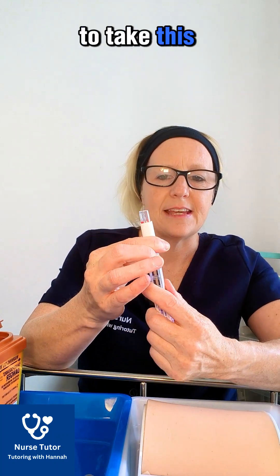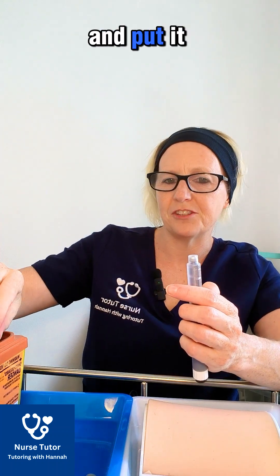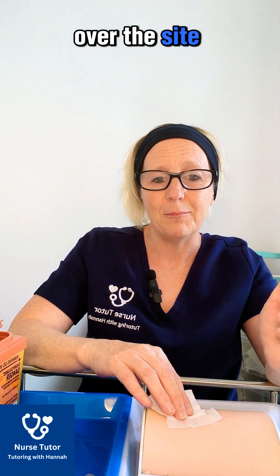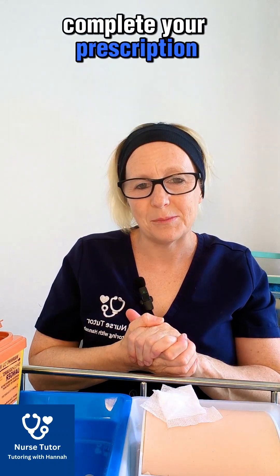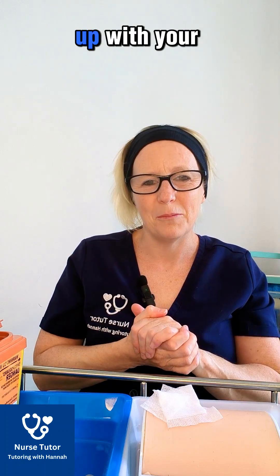It's safe and easy to remove the needle because the safety cap is on — just unscrew it and put it straight into the sharps bin. Don't forget to put your gauze over the site, but do not massage. Then decontaminate your hands, complete your prescription chart, ensure your documentation is done, and finish up with your patient.